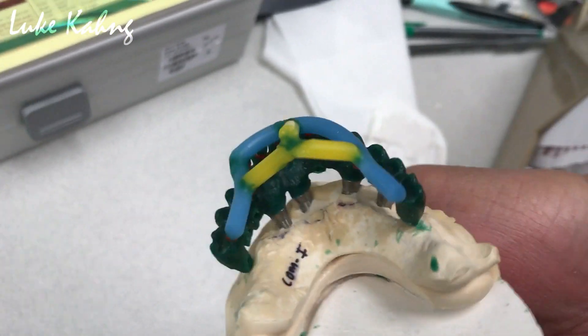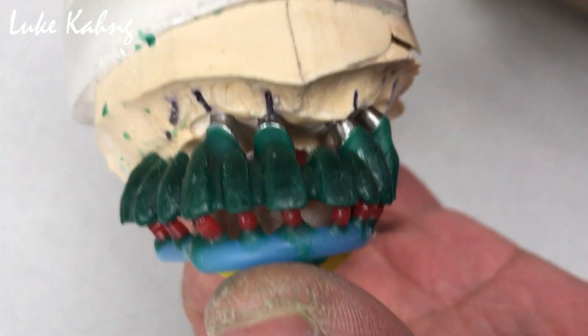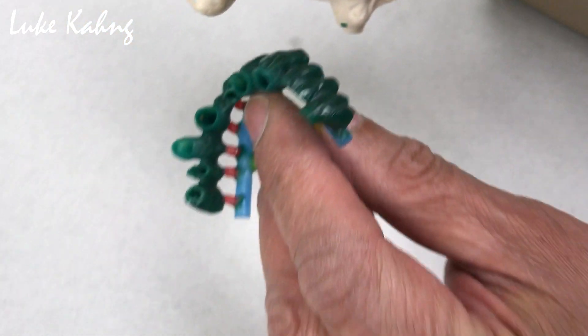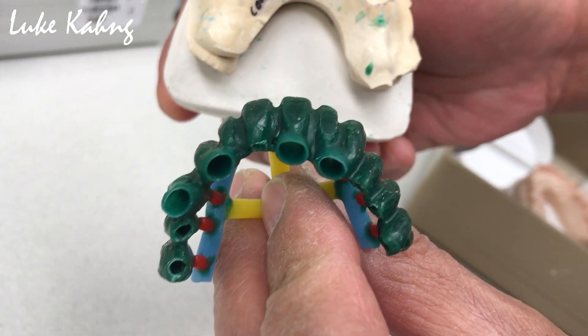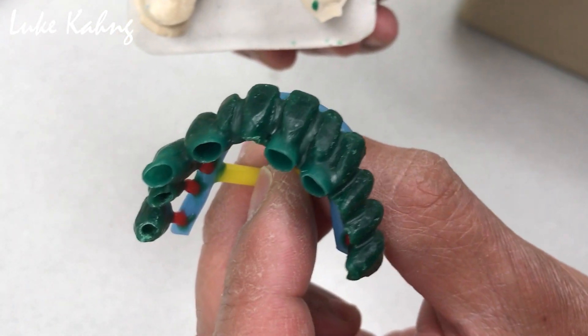Elvin will try to take it out — here's the Elvin technique. Straight go. And then we can put it into the investment, GC investment, and after casting we can show the final one later.